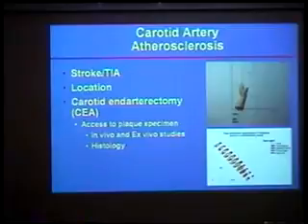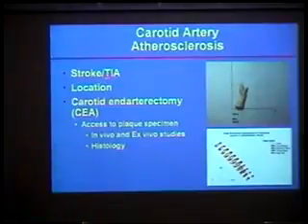So for us, the motivation for doing carotid artery, as I've said first, is that atherosclerosis here is directly linked with stroke or TIAs, the so-called transient ischemic attacks. The second, from the imaging point of view, is that these arteries are rather superficial structures. So we can use so-called surface coil technologies in MR to get as much signal as possible, which can be translated into better resolution images.